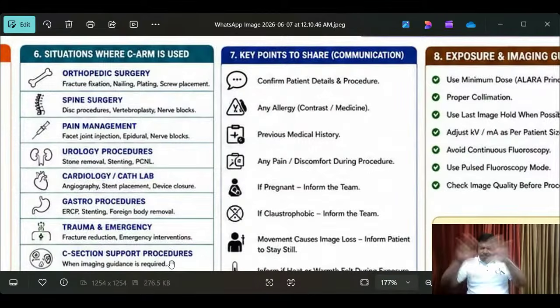Understand? Completely, why is the C-arm used in all these things? Because the C-arm is exposing X-ray, first of all. Next point is live monitoring and live capture of the image. We can see the image and we can implement the actions of the procedures. That is 100% useful to the doctors.